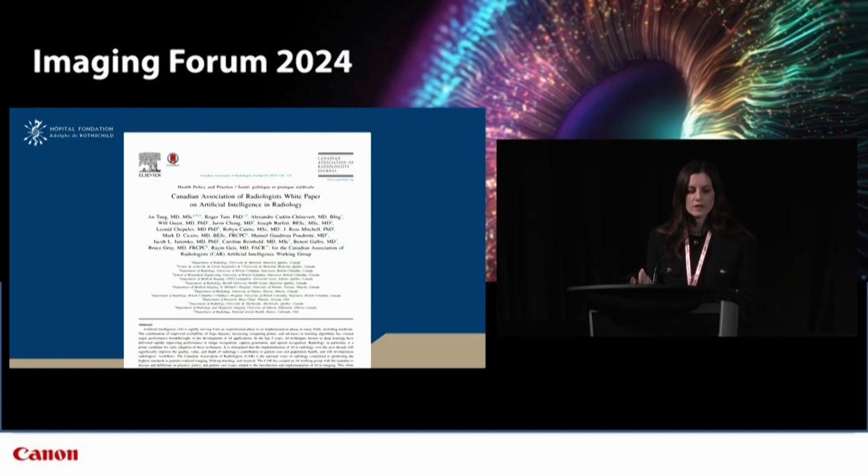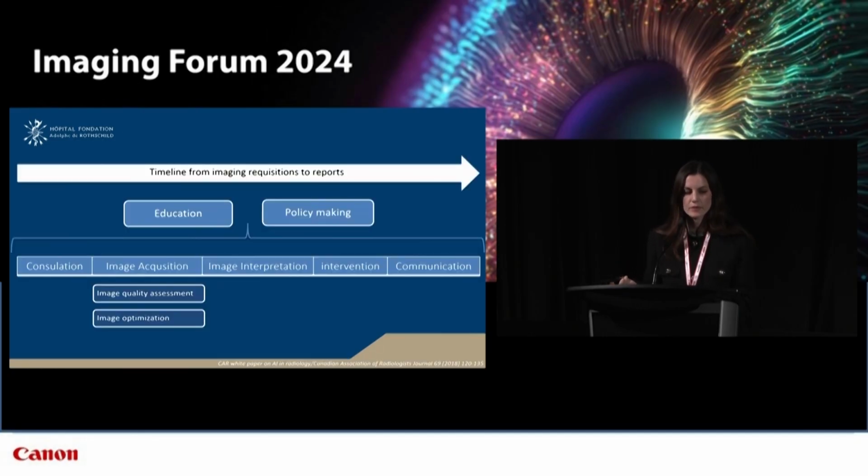And thankfully, the Canadian Association of Radiologists Artificial Intelligence Working Group provided just that with their white paper in 2018, in which they provided this diagram, which decomposes our day or our role into individual tasks, each task being a potential opportunity for AI, not so much to intervene, but to aid us in our daily clinical practice. Today, I am focusing specifically on image acquisition and the image quality stage of the timeline, complementary to the groundwork that Valentin has already laid in his talk just before lunch.